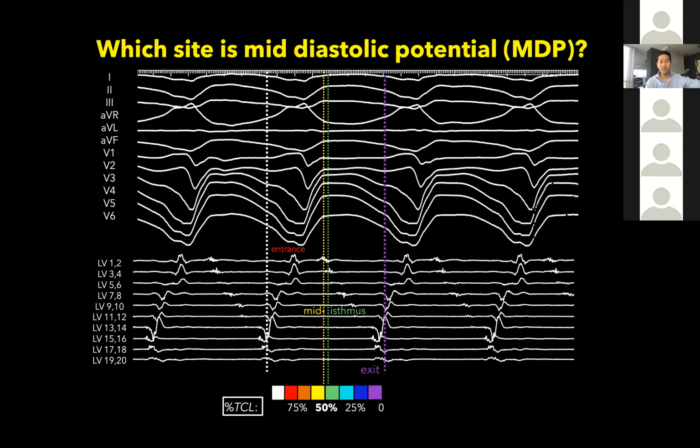Good. Then you've got the entrance, which is early. Entrance activation occurs inside the QRS. Exit activation occurs just pre-systolic before the onset of the QRS. So this is really nice in the era of multi-electrode catheters, to be able to get all these electrograms and then really be able to dissect out which components of the circuits you have by activation mapping, and then complement that with entrainment mapping.